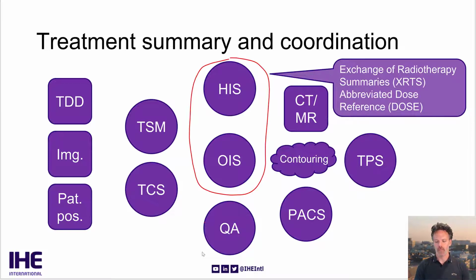That is including a summary of the most basic information of what dose was delivered, pretty much saying it was 2 gray, 15 fractions of 2 gray delivered to the target site. It could be prostate or liver. It could be more elaborate information, but it's mostly basic information of number of fractions and the magnitude of dose.